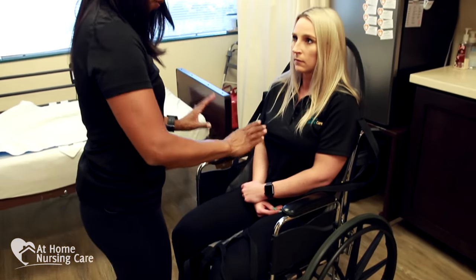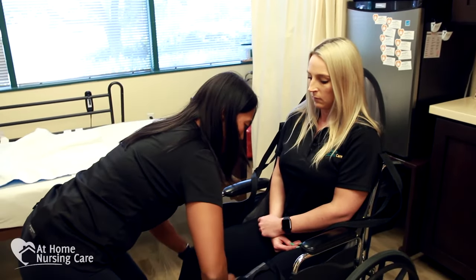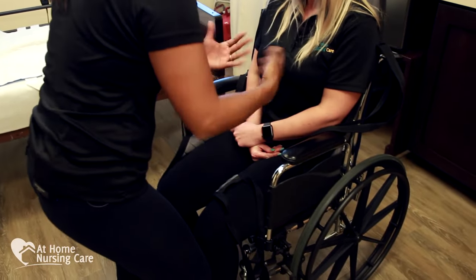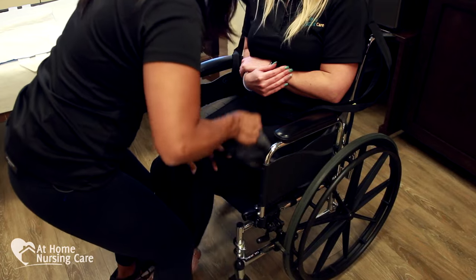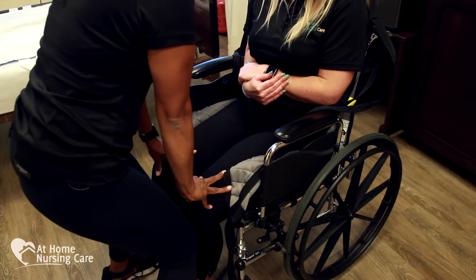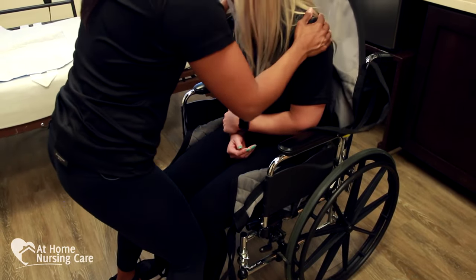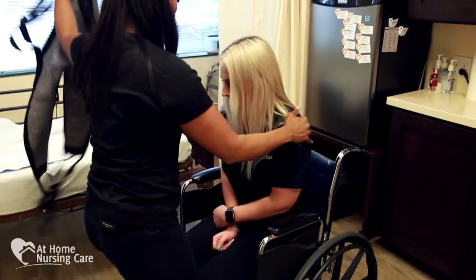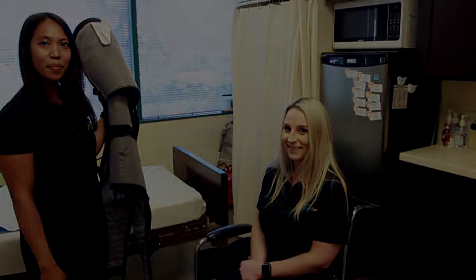Now to get the sling out from under her: the best way is to get the sling from underneath the leg and push it outwards. I'm in front of her to make sure that if she has instability in her trunk, I'm there spotting. Once she's in position, I'm blocking the knees and I'm going to slightly ask her to come forward, and then I can just pull out the sling easily. And that's how you would safely get your client into the wheelchair from the bed.